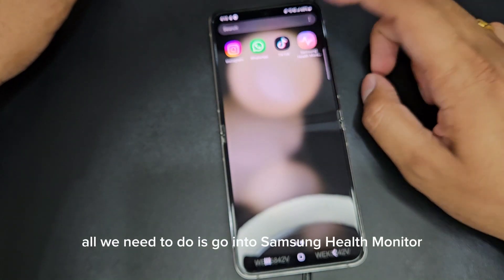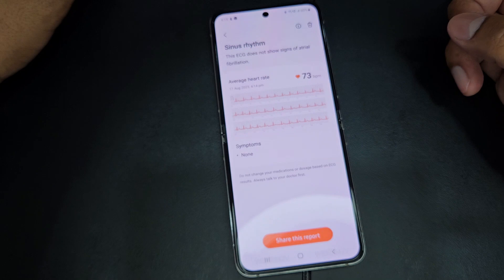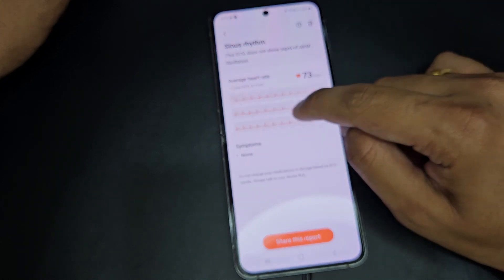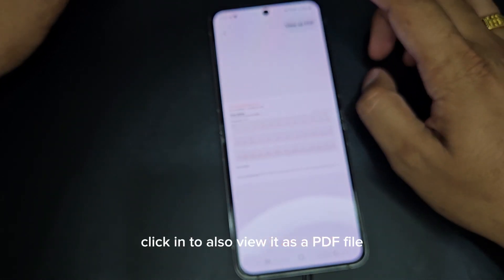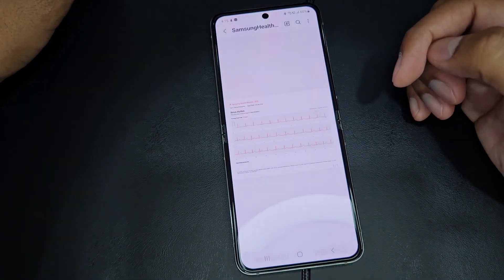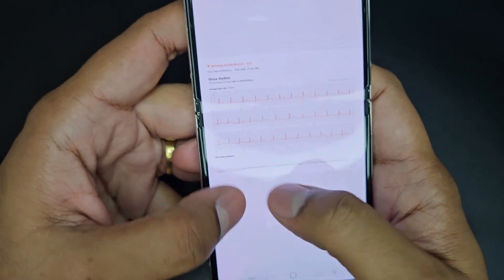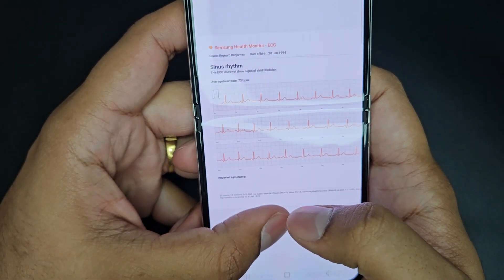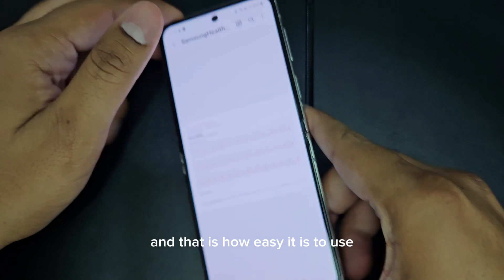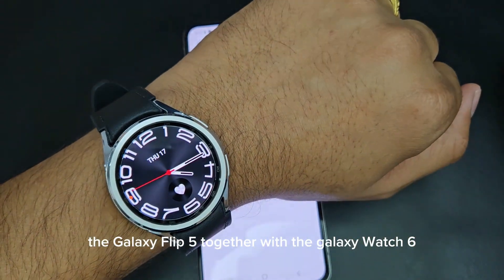All we need to do is go into Samsung Health Monitor and look for the report. Click in to also view it as a PDF file — so there you have it, your ECG report. And that is how easy it is to use the Galaxy Flip 5 together with the Galaxy Watch 6.